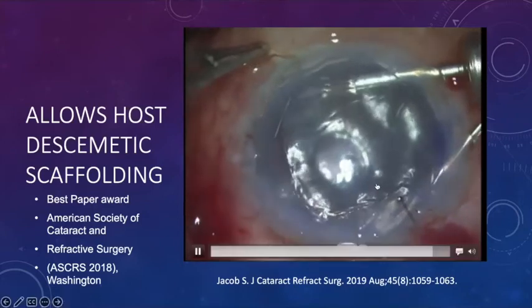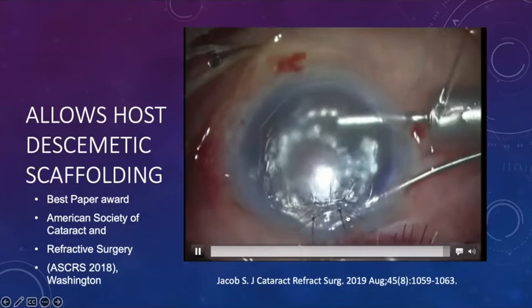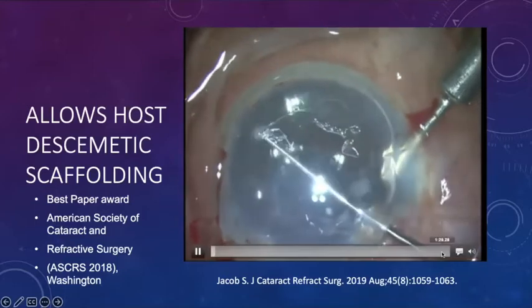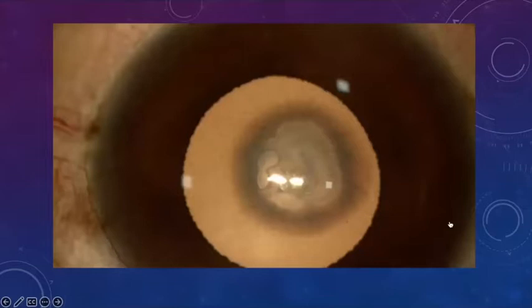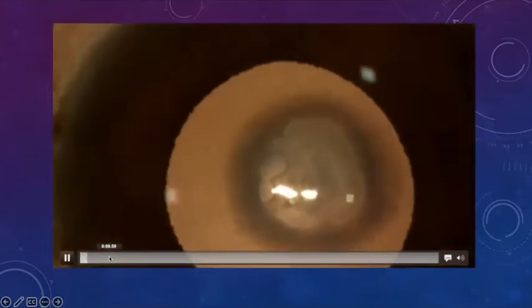Sometimes I also do wound scaffolding where, if the graft is very large, we place part of the graft into the wound, and you can see that's what we've done here, and the cornea looks pretty good. Of course, you cannot have it in a way that it comes out of the wound. It should be only 50% within the wound and not more than that. And we have mentioned all these techniques in the JCRS article, and all the precautions to be taken when you're doing these techniques.